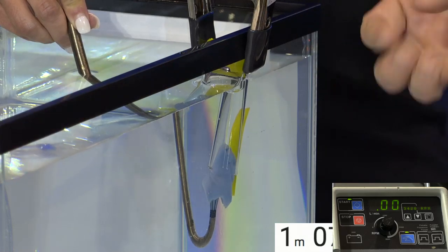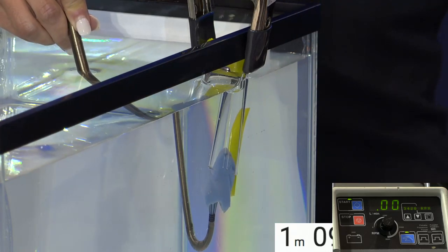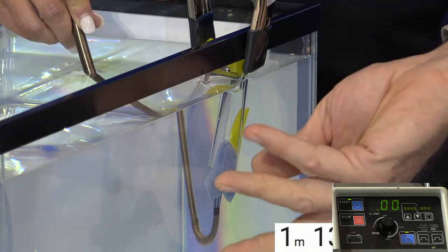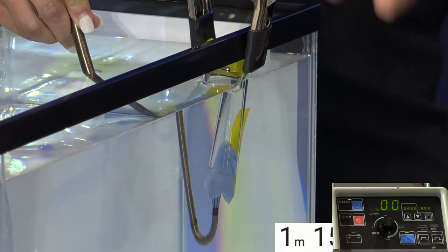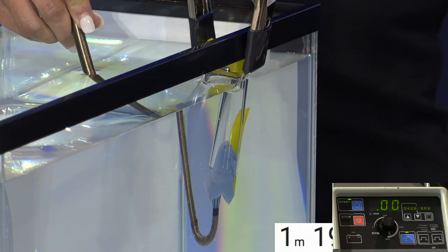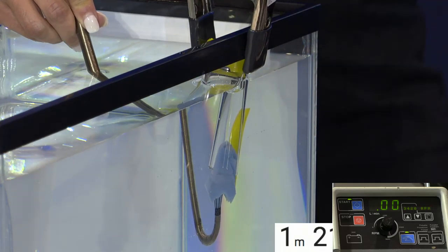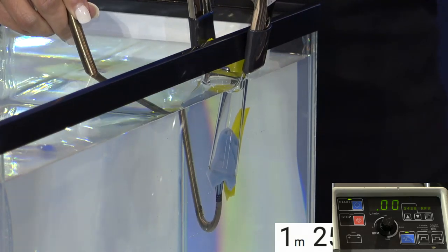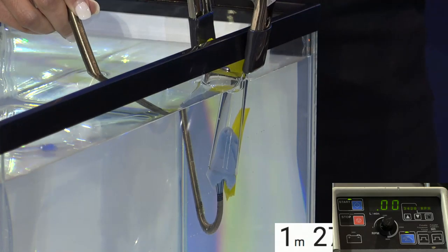instead of clamping it, because if you clamp it, you can get a little bit of forward pressure, release it, and you've freed it from its spot of origination, and now you're going to have to chase it out of the atrium. So we want to stay on. During our pre-case plan, we've determined the size, the shape, the mobility, the density, and whether there could be a need for a cut down in this space.